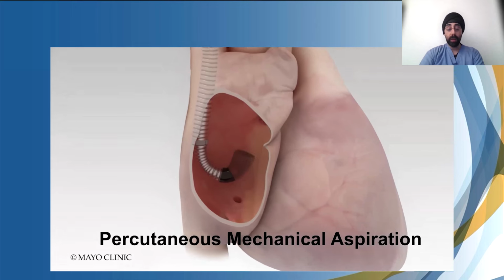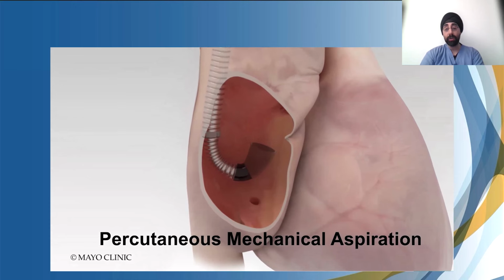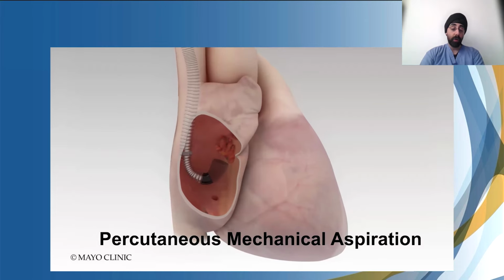And certain patients will be appropriate for surgical intervention. For those who we think surgery may not be the best option, we do have catheter-based approaches where you can effectively remove the vegetation and use it for a variety of reasons.